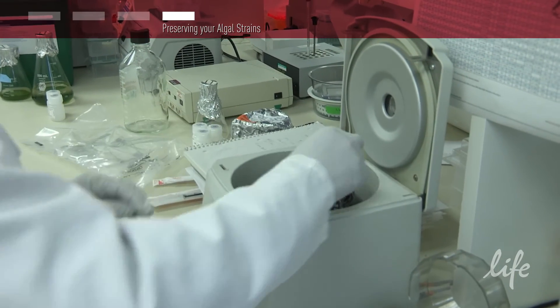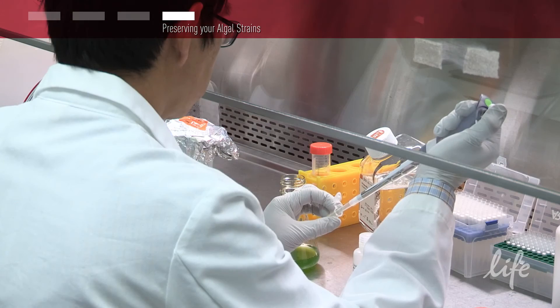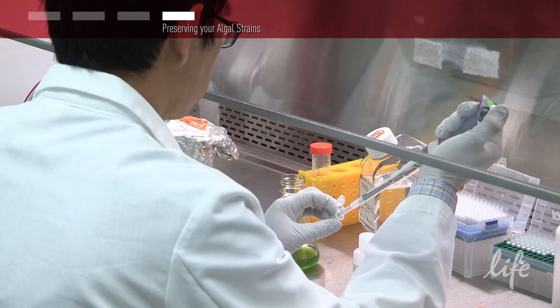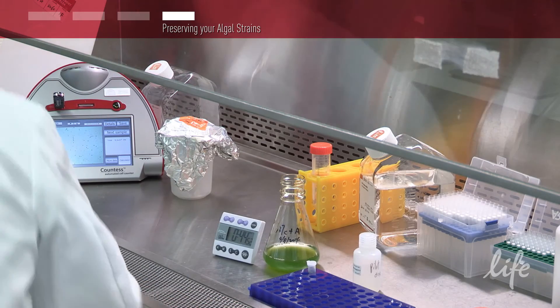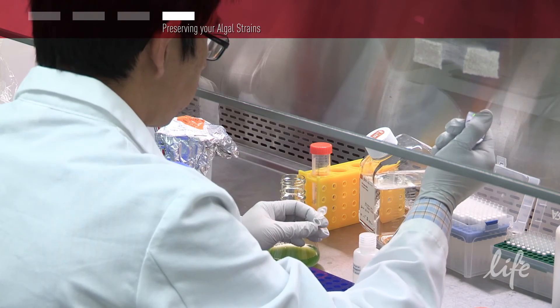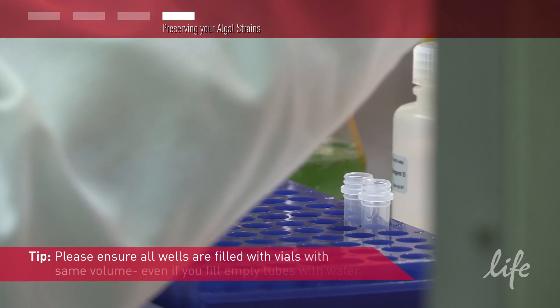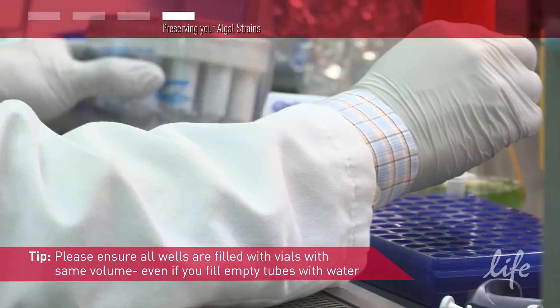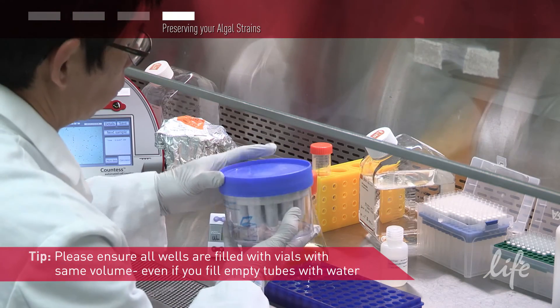Now spin the cells down in a 1 ml tube for 2 to 3 minutes. Resuspend the pellet in Reagent B to 10 million cells per ml and incubate for 45 minutes at room temperature. Next, transfer 240 microliters to a cryopreservation vial. Add the vials to the Nalgene Mr. Frosty and let this sit at room temperature for 30 to 45 minutes.